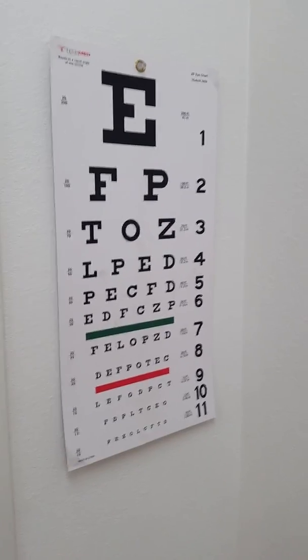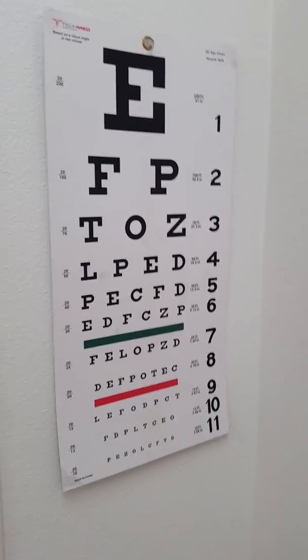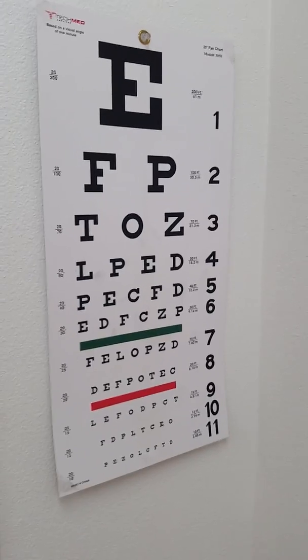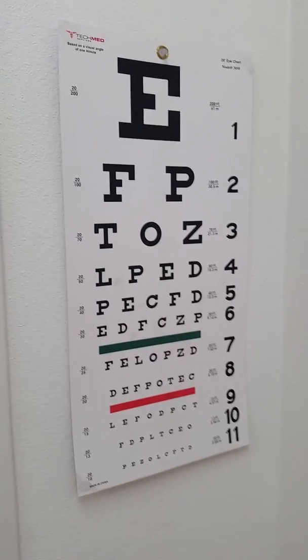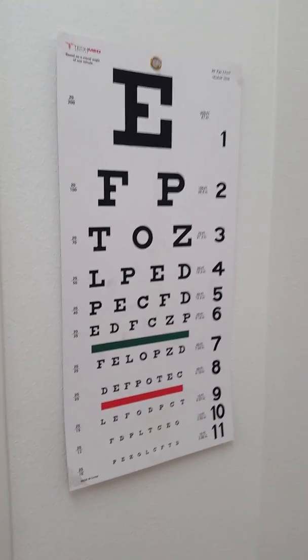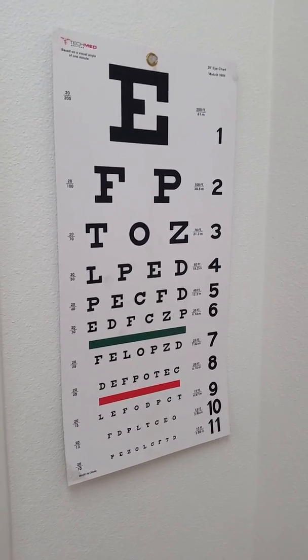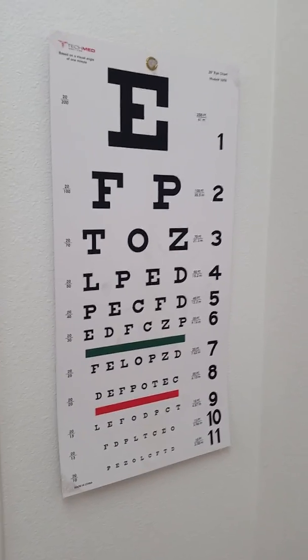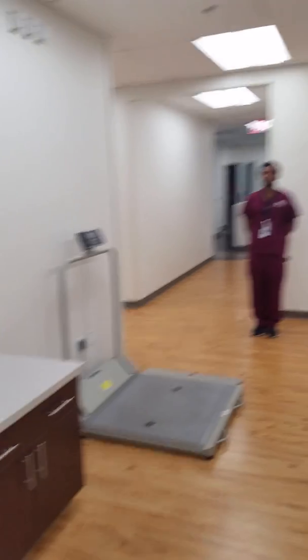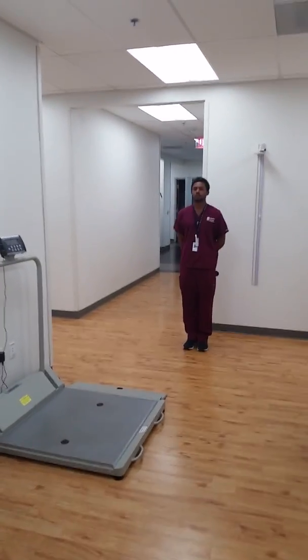We're going to now quickly talk about the Snellen chart. The Snellen chart is placed on a wall at a location easily observable from approximately 20 feet away. If you're using handheld Snellen charts for people who are myopic, make sure to use the distance recommended on that chart. For the full-size chart in a doctor's office, have the patient stand approximately 20 feet away. The student doctor will now direct the patient on how to do the exam.